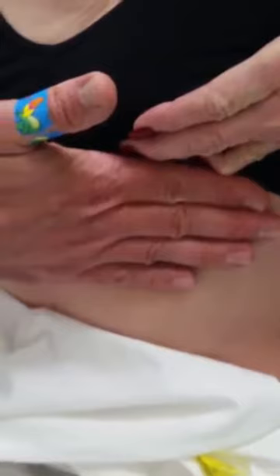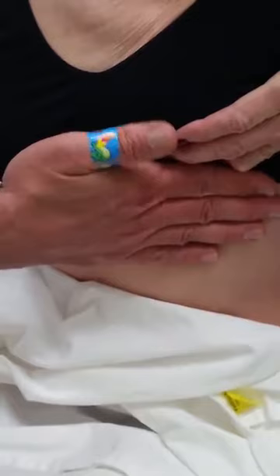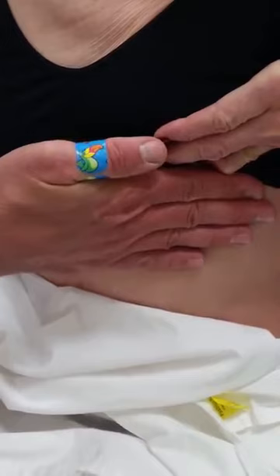You can also move your hand across the ribs because this is where you'll feel for palpation of the apex of the heart, feeling for any thrills, heaves, or lifts. You're also going to palpate for these three items over your other previously assessed listening posts.